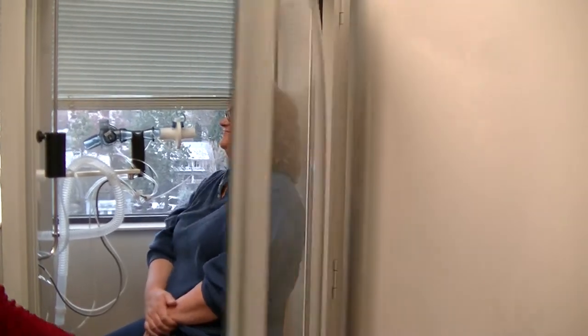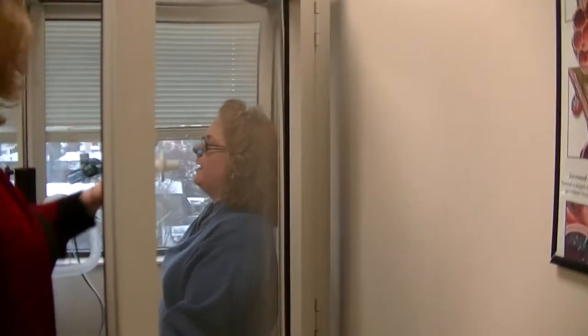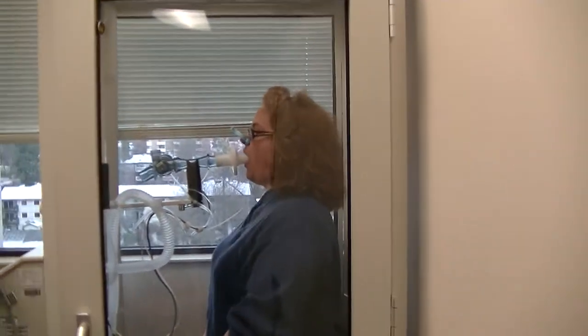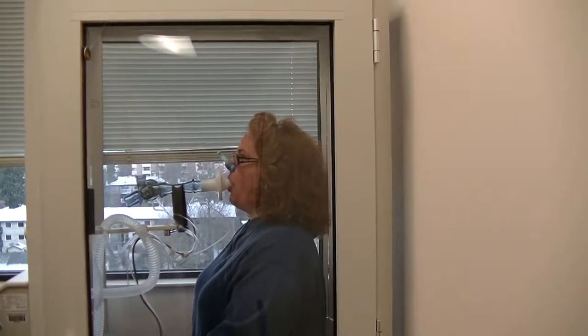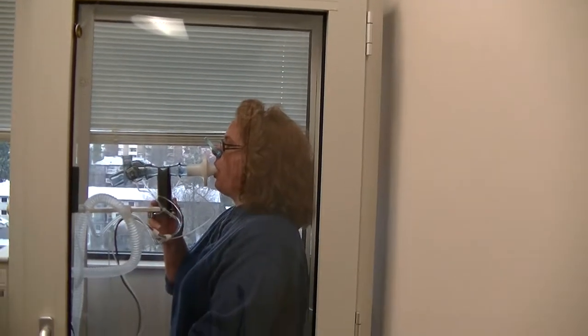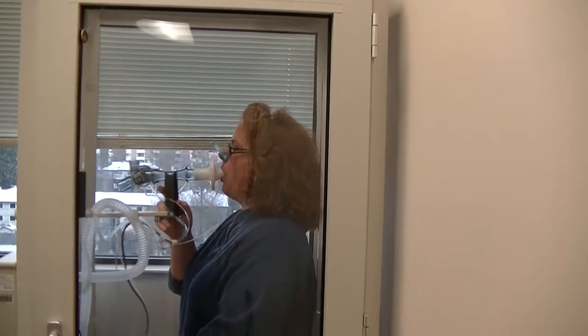Okay, we're going to do that one more time just like that. And then you're three quarters of the way done, maybe even further than that. You did very well. Regular breathing. Oh, are you alright? I hope so. Regular breathing. Just in and out. Nice little tidal breaths.